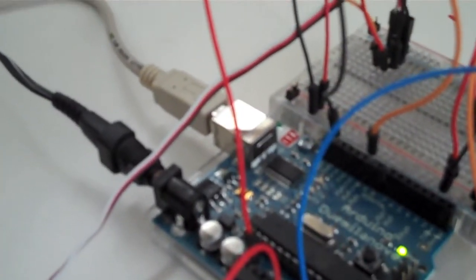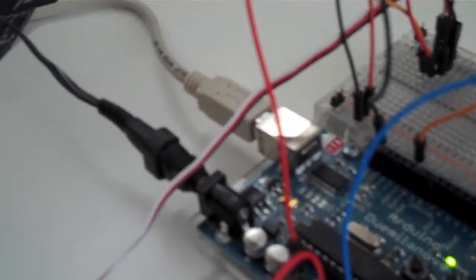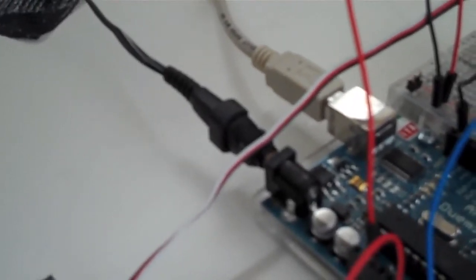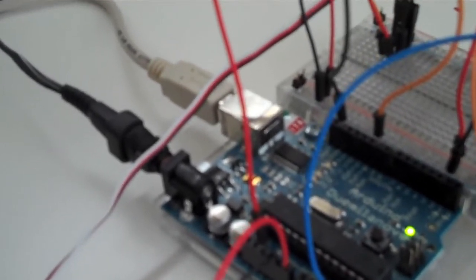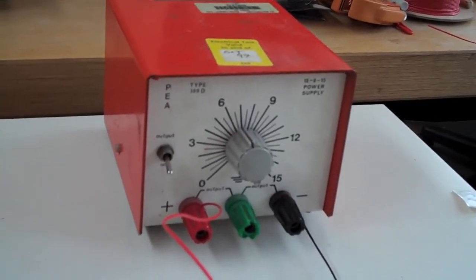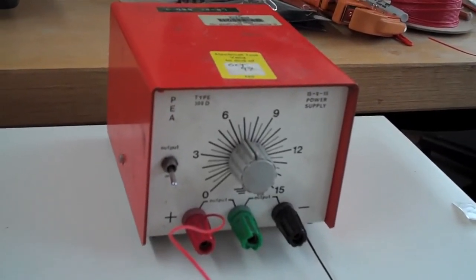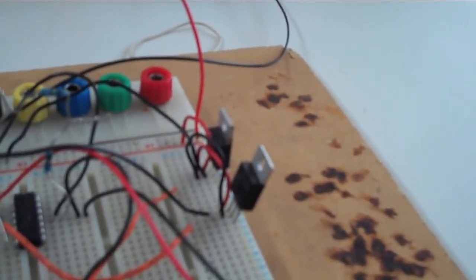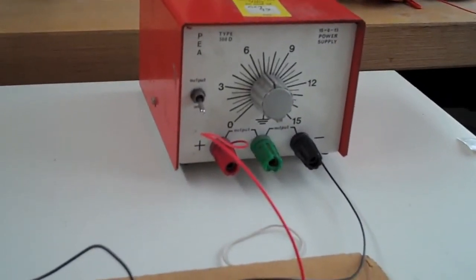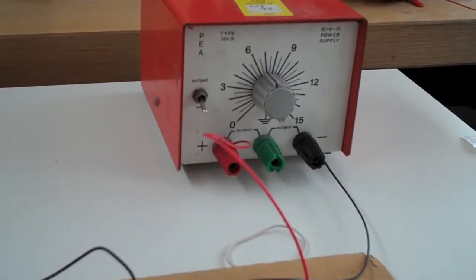I'm currently supplying the Arduino with power via the USB cable, and also power via a 9 volt power supply unit. It's not best practice because there are ground issues all over the place, because I'm supplying the breadboard with a third power supply, which is supplying around 11 volts, which is being regulated down to 5 and 10 respectively. Ideally we want one power supply with one ground across all boards. Again, this will prevent noise of any kind.